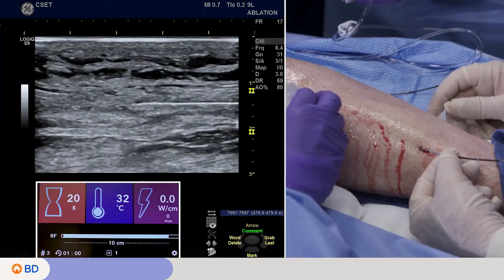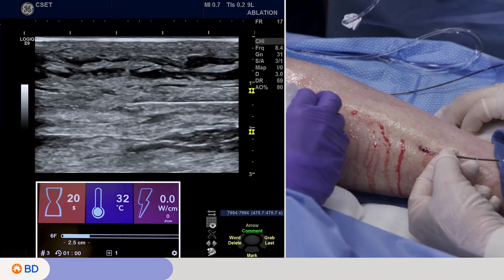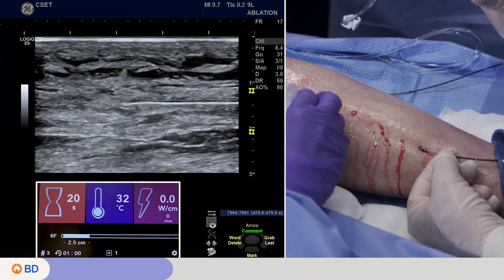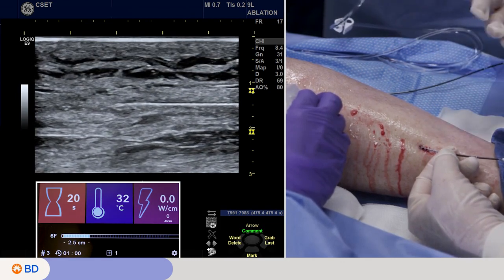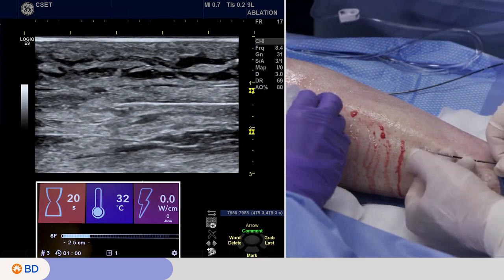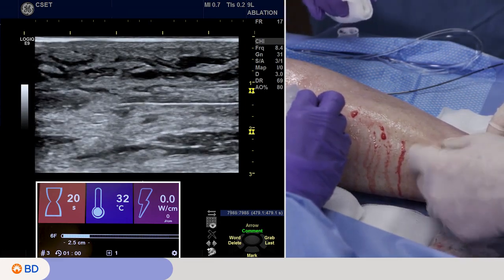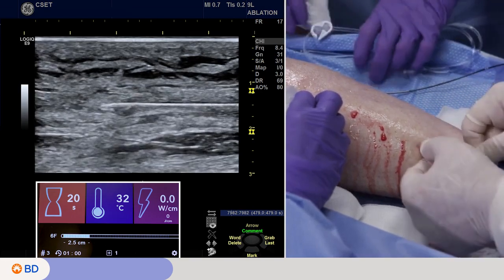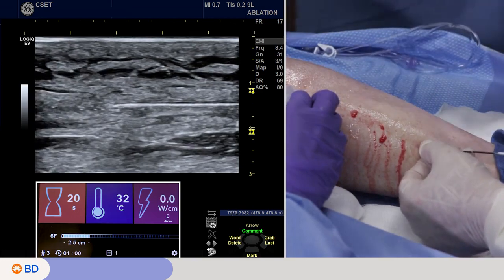And so Karina's going to switch the catheter, and just a simple push of the screen. You can see it went from a 10 centimeter coil treatment length to 2.5 centimeters, and we have an audible feedback where the tone changes to know that it's doing that. I like to hold my hand. If I see the coil out of the skin, I put my hand there so that it will burn my hand if there's a malfunction or we didn't hit the button. I just use that as a safety precaution. And then we activate it once we're certain about this.